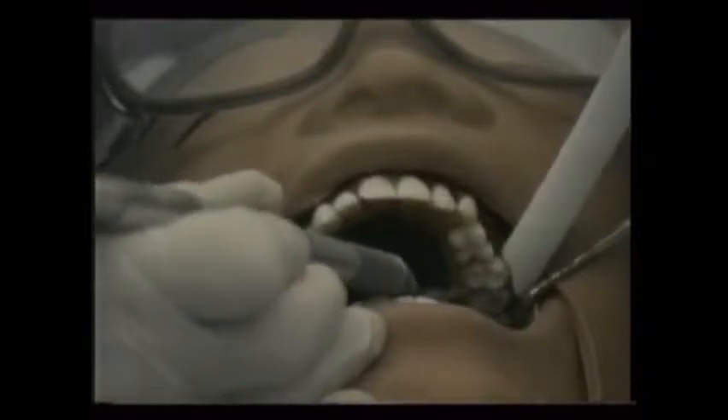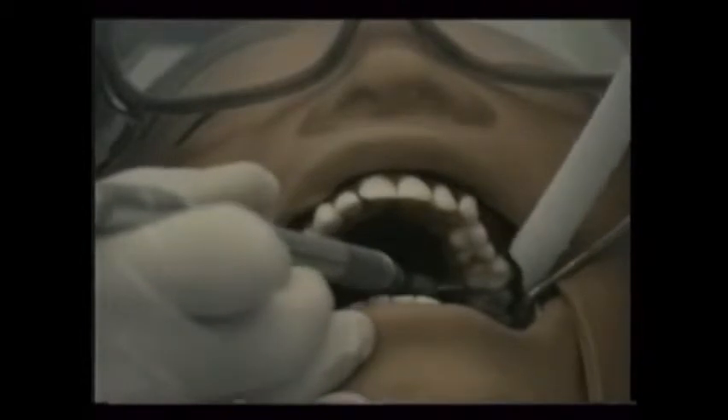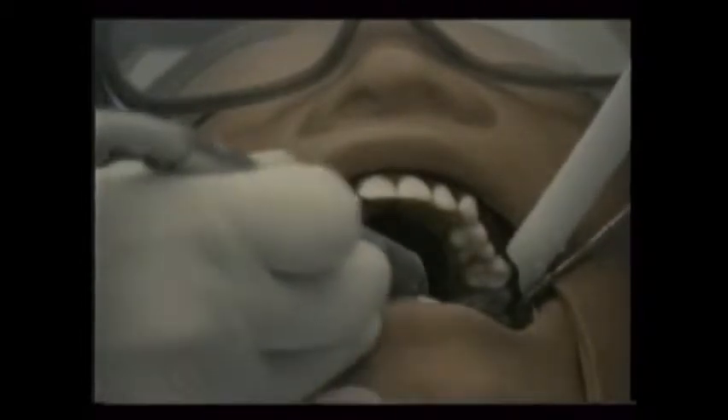Your dentist will have his favorites for the different procedures that your practice provides. It's important to become familiar with all types of burrs, though, in case they become needed.